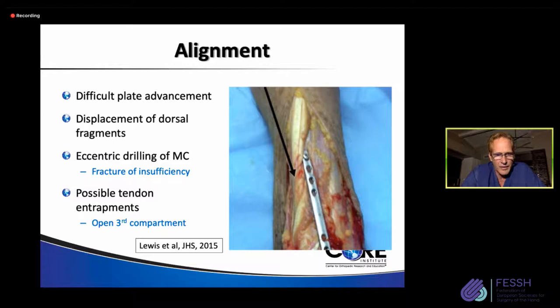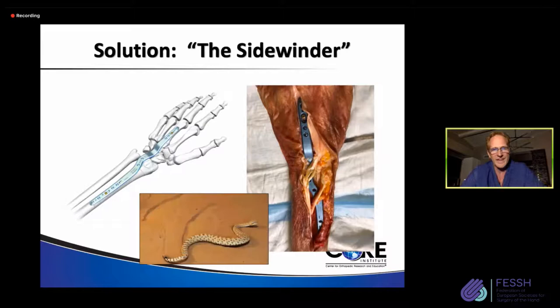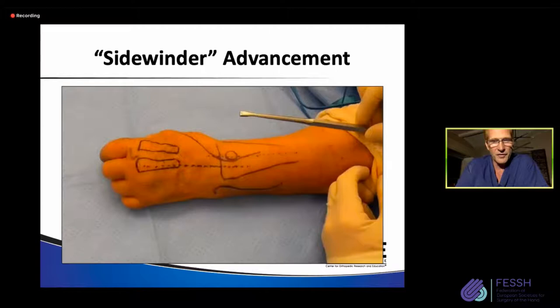So Medartis came out with something called the Sidewinder, and this is nicknamed because, I don't know if many of you know this, but there is a rattlesnake that's indigenous to my area of the country around the desert climates that has a very unusual pattern of mobilization as it winds around. Playing off this, we nicknamed it the Sidewinder. The reason we do this is because it curves around the problem area. And I have a video to show you what's happening exactly and how we pass this plate.